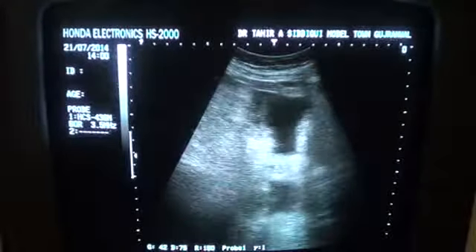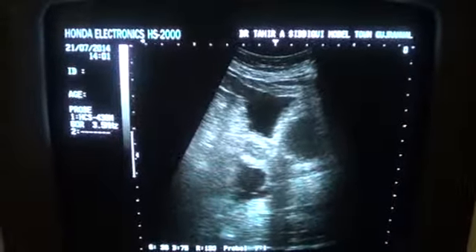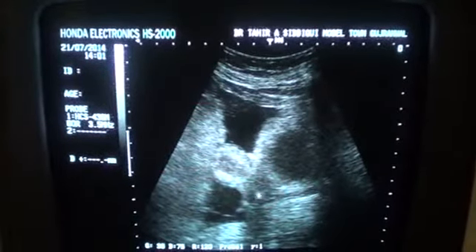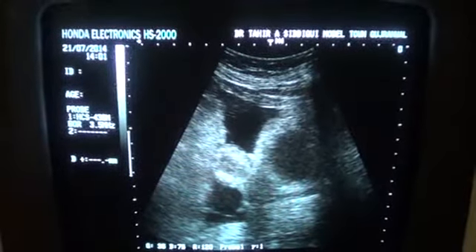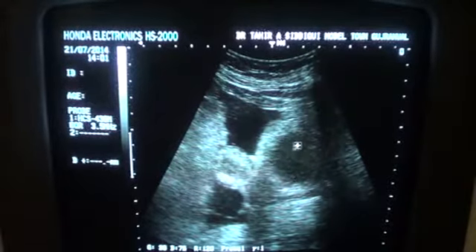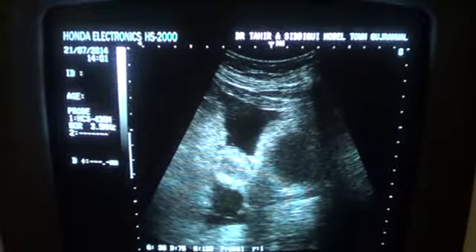Here we see ascitic fluid. This is the postmenopausal uterus seen through ascites. Tiny calcifications are seen in this uterus. This is the urinary bladder. This fluid is representative of ascites. This fluid is also representative of ascites.